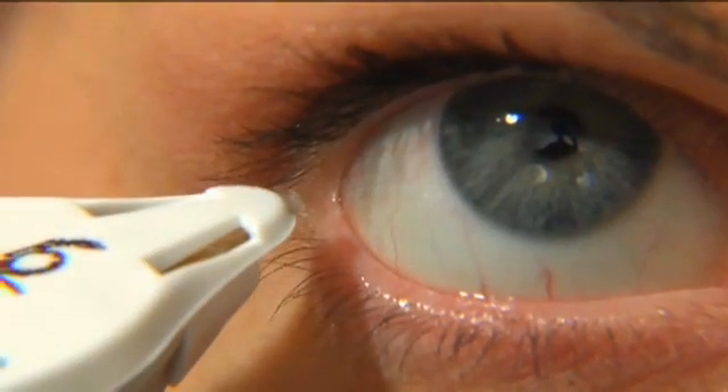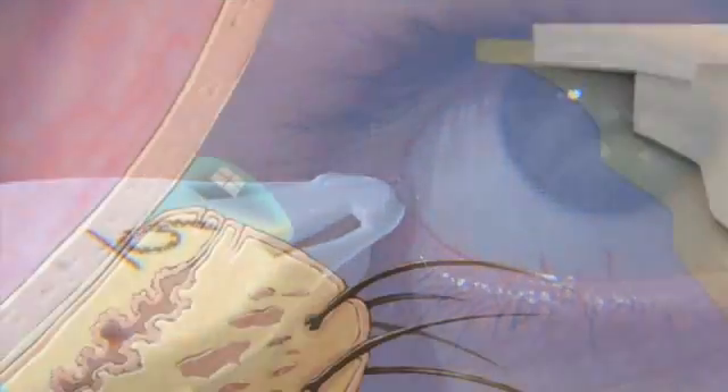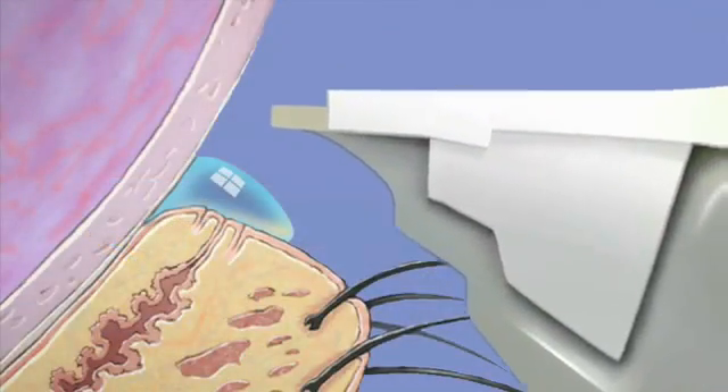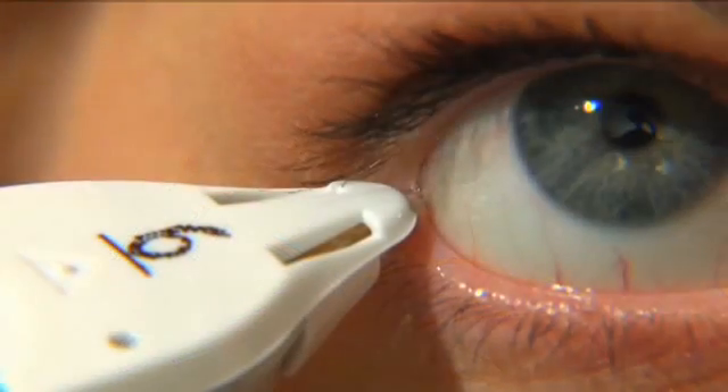Position the pen beyond the eyelashes near the corner of the eye. Tears are collected on the bottom of the tip of the test card. Lower the pen until the bottom of the tip touches the line of moisture on top of the eyelid.